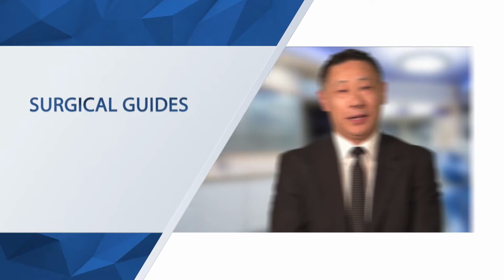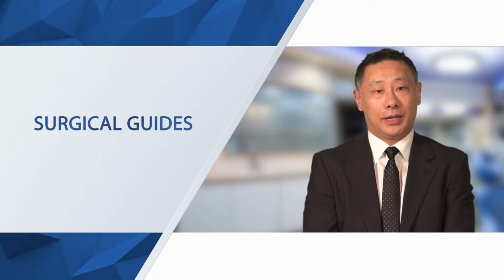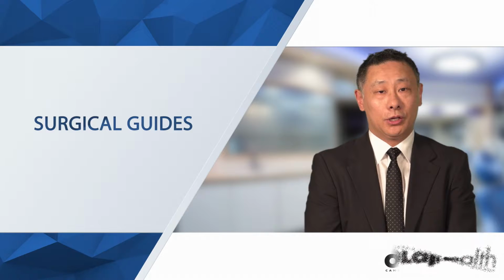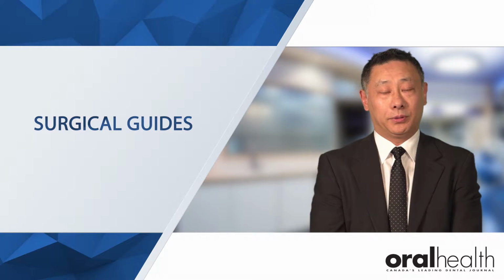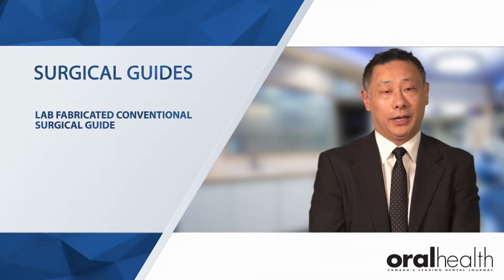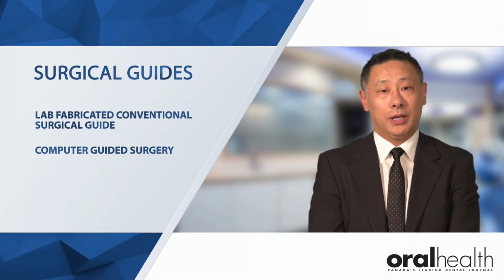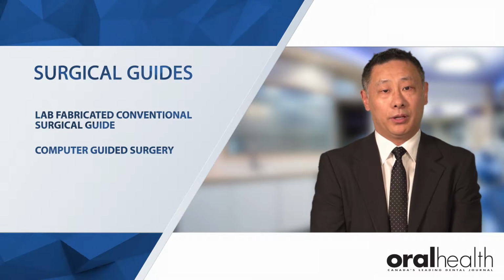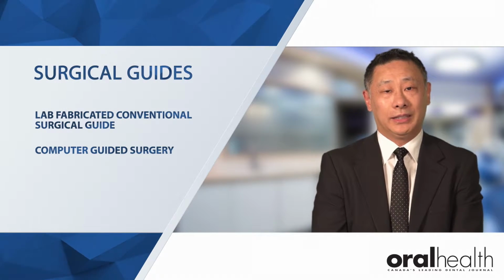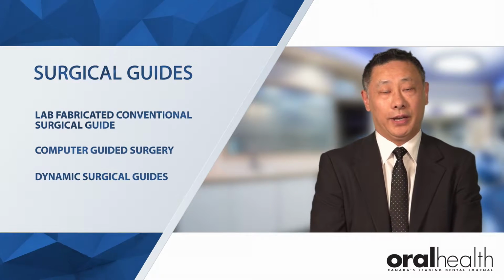I've been asked frequently a lot of questions regarding different surgical guides utilized for implant surgeries. So essentially there are three different types of guides. One is what we call the lab fabricated conventional surgical guide. The second one is the computer guided surgery. And then more recently, some of the newer innovations involve dynamic surgical guides. So I wanted to just talk about the differences, advantages and disadvantages.